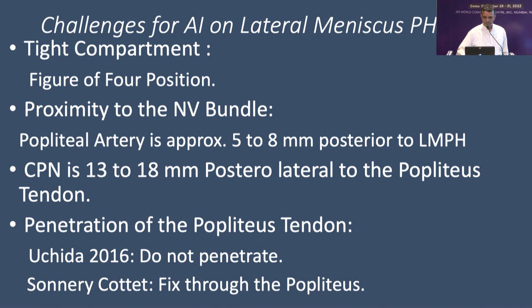There are a lot of challenges in lateral meniscus repair. First is the tight compartment. On the medial side, if the compartment is tight, we can go ahead with pie-crusting. But on the lateral side, there is limited joint space, so you have to have a good assistant who will give you the figure-of-four position and open up the joint for the procedure. Next is proximity to the neurovascular bundle.